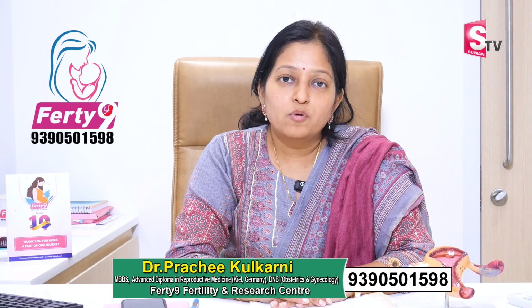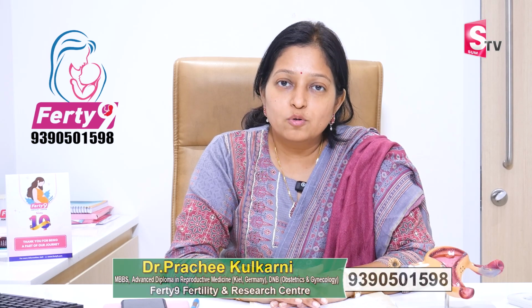Today I'm going to talk about hysteroscopy. So what is hysteroscopy, how it is done, what issues are dealt with the procedure of hysteroscopy. So hysteroscopy is actually an endoscopic procedure, which means it is minimally invasive and it is done to visualize the inside of the uterine cavity. There is a hysteroscope which is half the size of a pen, and a camera is attached to the hysteroscope so that when we enter the uterus with the hysteroscope, we can visualize the inside of the cavity on a separate screen which is attached to the camera.